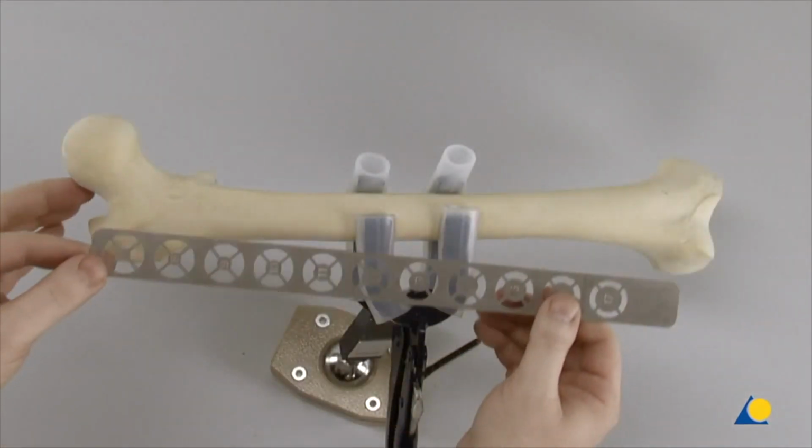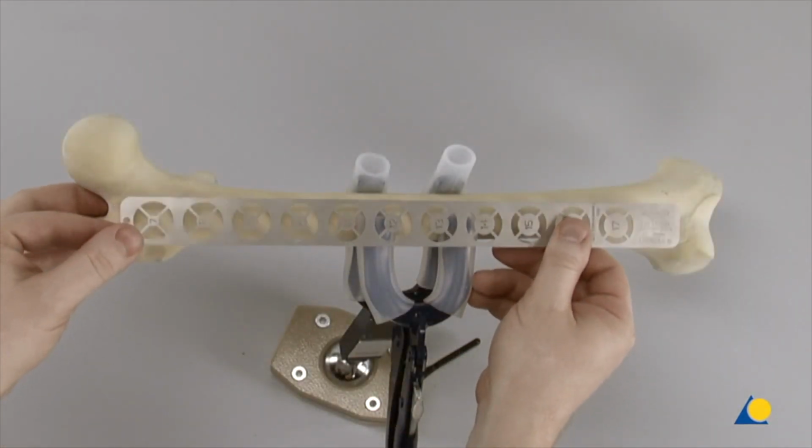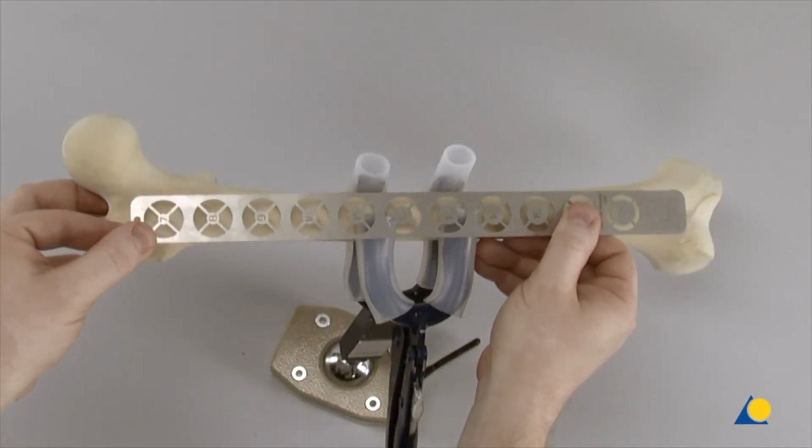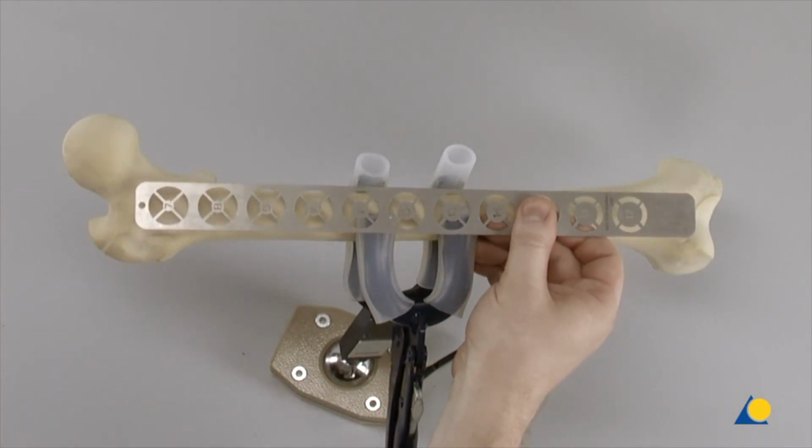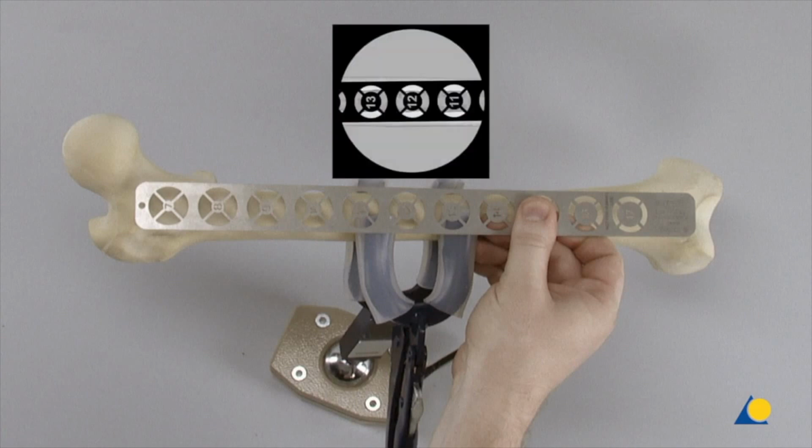The nail diameter is determined by repositioning the image intensifier for an AP view of the femur at the level of the isthmus. The radiographic ruler for nail diameters is placed on the narrowest part of the isthmus, and the estimated diameter is measured from the circular indicator that fills the canal.